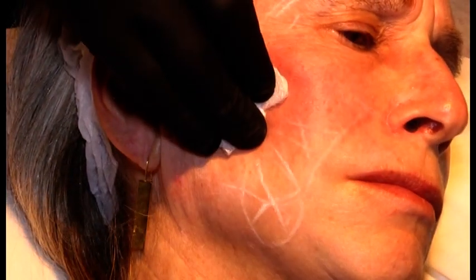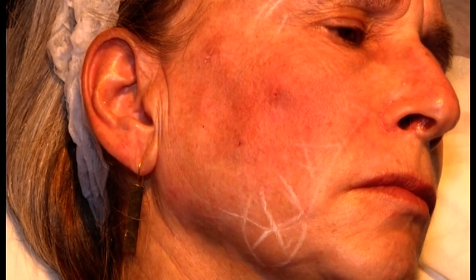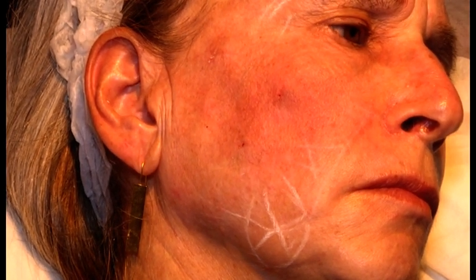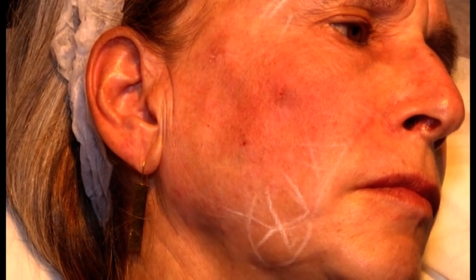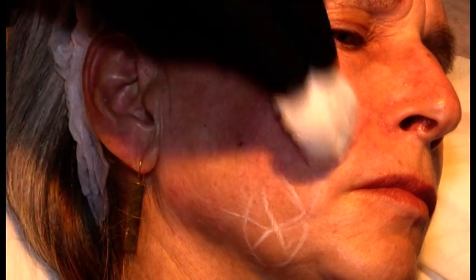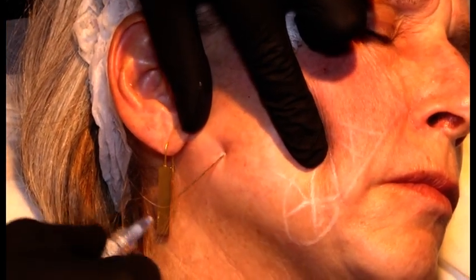And then the last entry point, I will put some more product into it. And so from here, I will treat the lower part of the face.